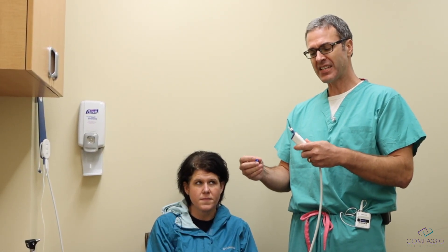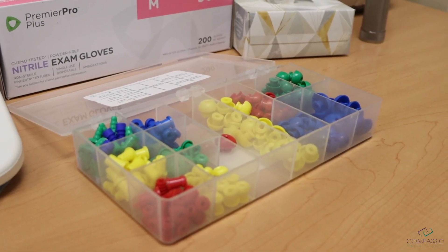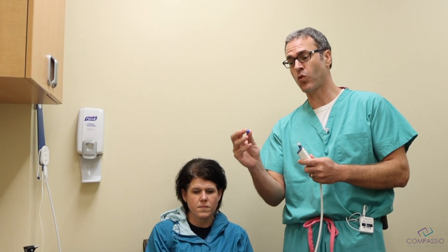Basically what it is, it's a little probe, and we have different size rubber attachments. We base that on whether it's a pediatric patient or an adult patient.